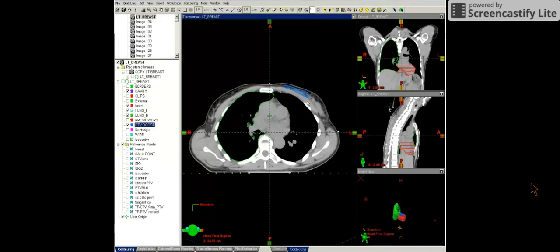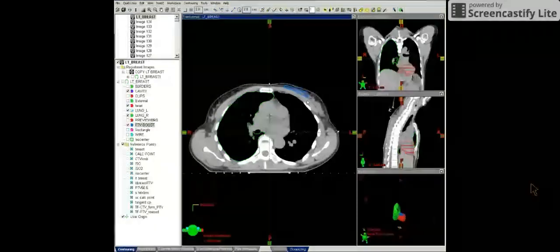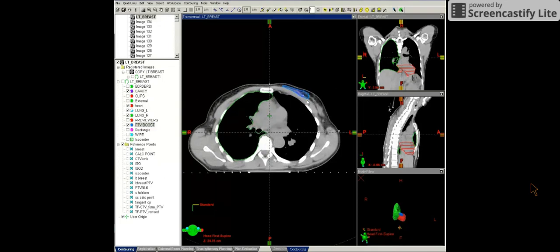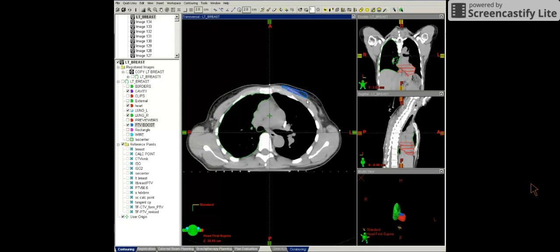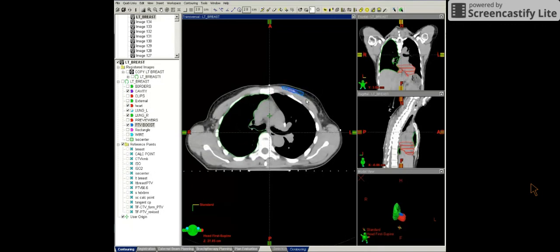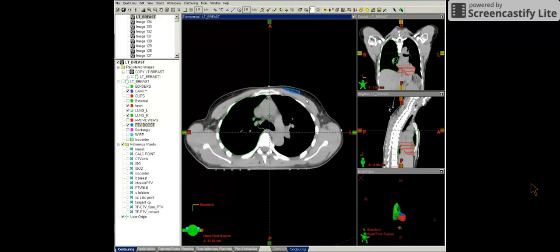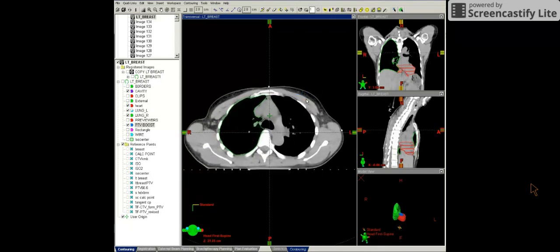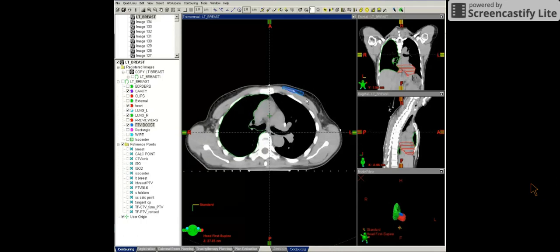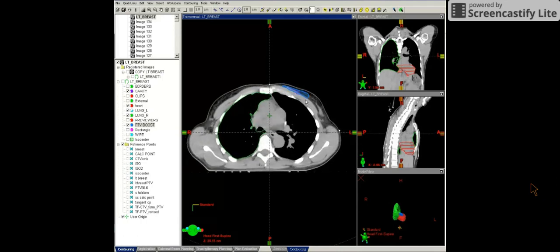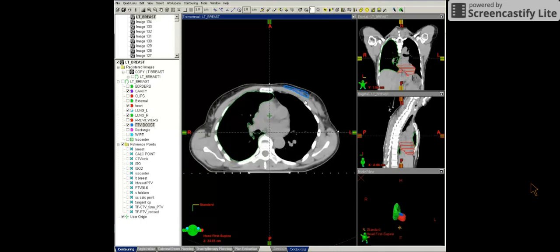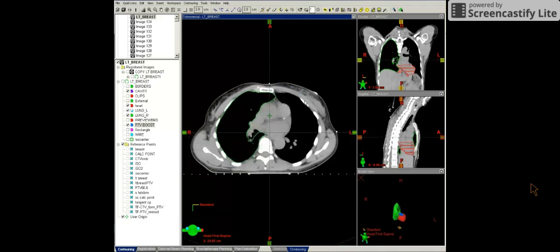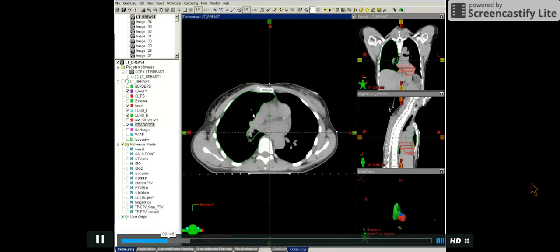And then there's a margin around the cavity, which we've called PTV boost. And this has been resected from the skin and from the pectoral muscle, as you can see. So this defines our PTV boost.